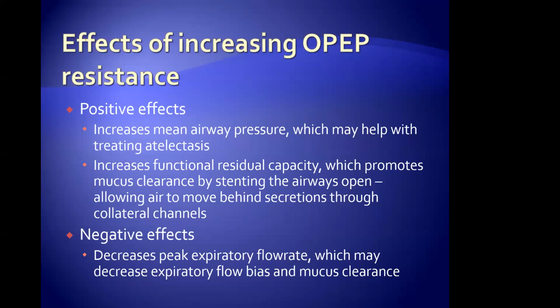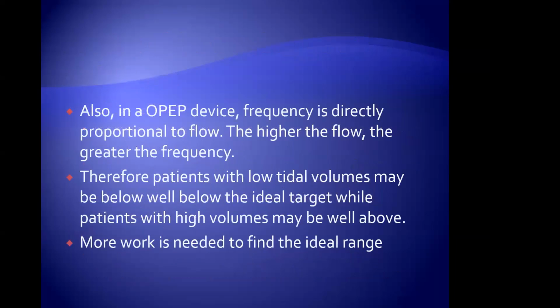The negative effects: remember we talked about the IE ratio difference? Not so much. But I want that volume at the FRC at the alveolar level, opening those alveoli up, and then moving secretions, coughing, spitting, and don't spit on the therapist. Also, in an OPEP device, frequency is directly proportional to flow.